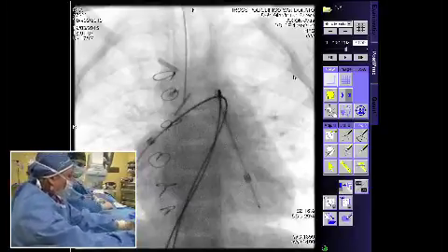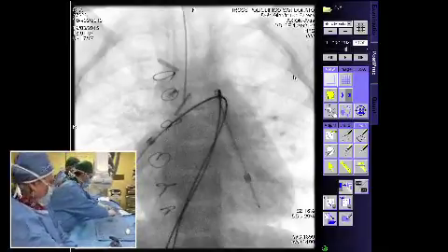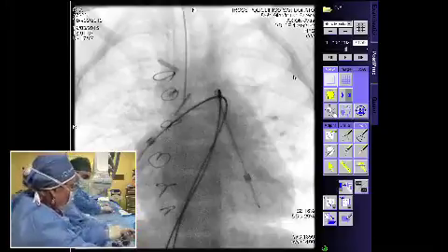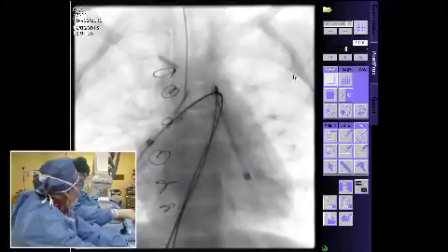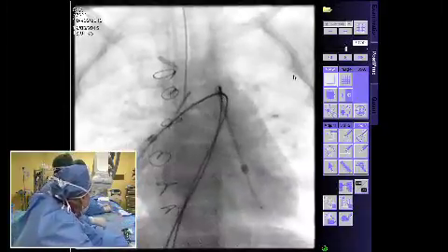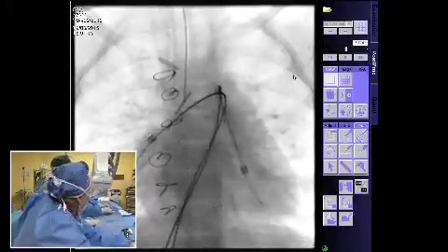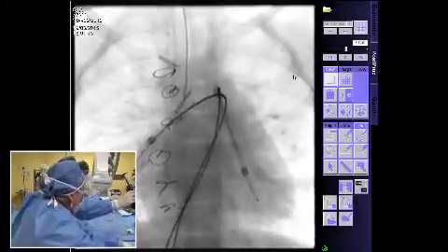So, Gianfranco, it's John. Yeah, hi, John. You showed the beautiful image of your pulmonary that Philip was gushing over, and that's part of our modern imaging now. Are you going to use that, not just for a roadmap, but to tell you the absolute perfect angle to implant these stents on? In other words, what angle did you get that on your 3D reconstruction, and then do you go back to that angle when you do the implant?